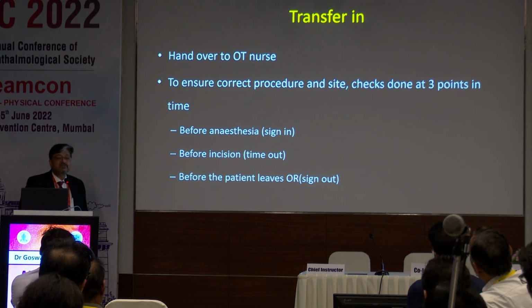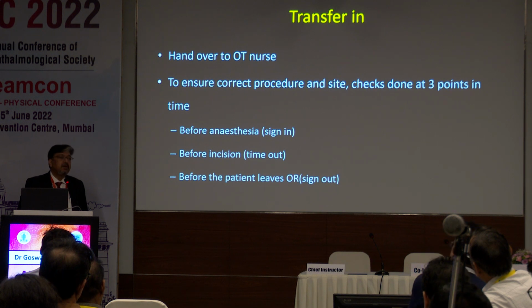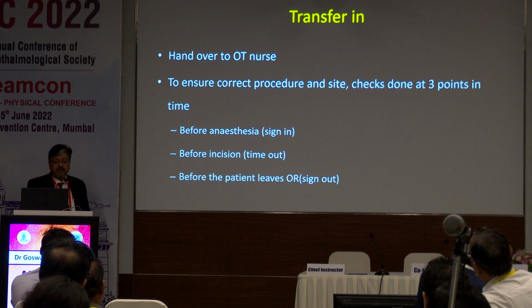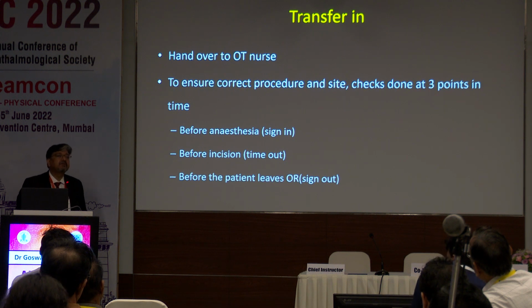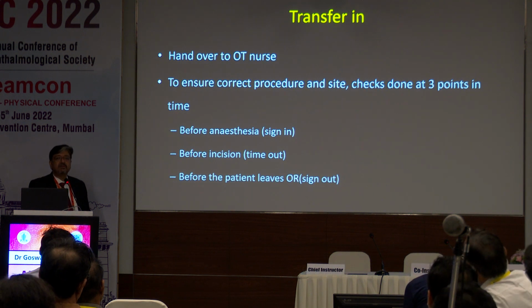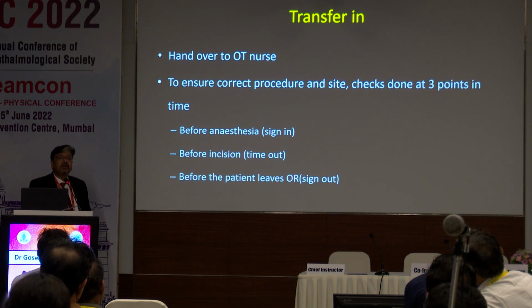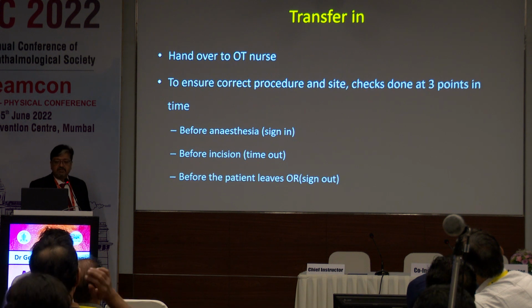At the time of incision, just before starting, is known as the time-out. Again here, the nurse checks whether all the surgeons and anesthetists are around and everything is nicely prepared or not. And the last step is sign-out. When the surgery is over, in case of other surgeries, you check for gauze and all that, but in eye surgery, we don't do that. But we see that the pad bandaging is done properly, the eye is nicely closed. If you're doing topical, the patient closes his eyes properly without any difficulty, and a discharge note or a post-operative order is given at this stage.